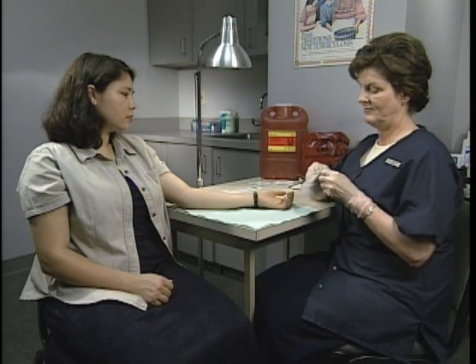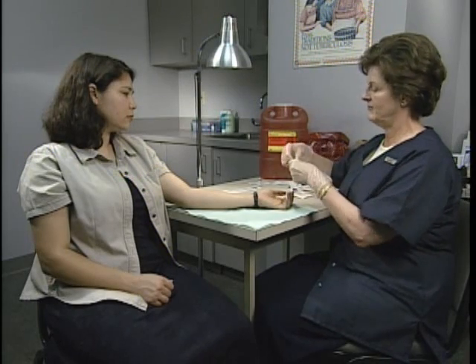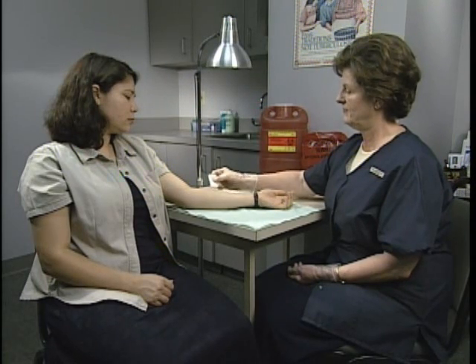It's not unusual for a drop of blood to appear at the injection site, even when the needle is inserted properly. Should this happen, lightly blot the blood away with a 2x2 gauze pad or cotton ball. Do not cover the site with an adhesive bandage because the adhesive could cause irritation and interfere with the test. Properly dispose of the contaminated gauze pad.